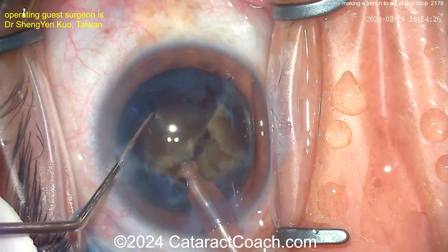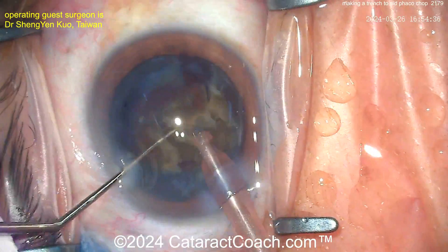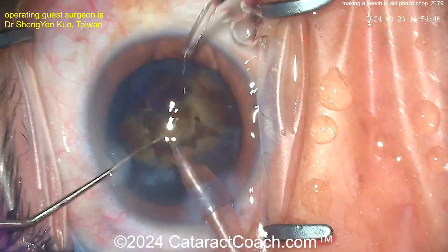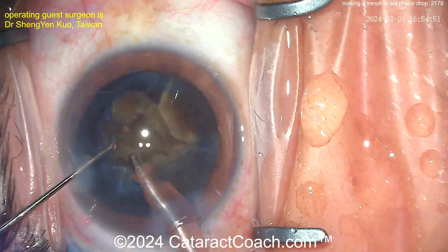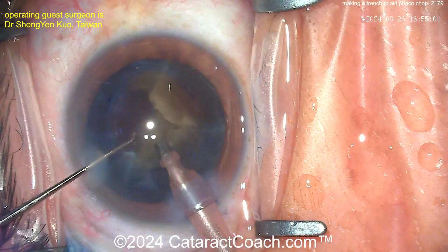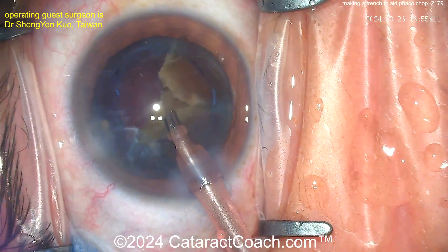Going in with the phaco probe, the pieces can come out pretty easily — there's very good separation. You can sub-chop them as well, but that fibrous nature makes it difficult to fully separate the pieces; you may need multiple attempts at the chop. Be persistent, but it's a beautiful technique — I really enjoy watching this video.